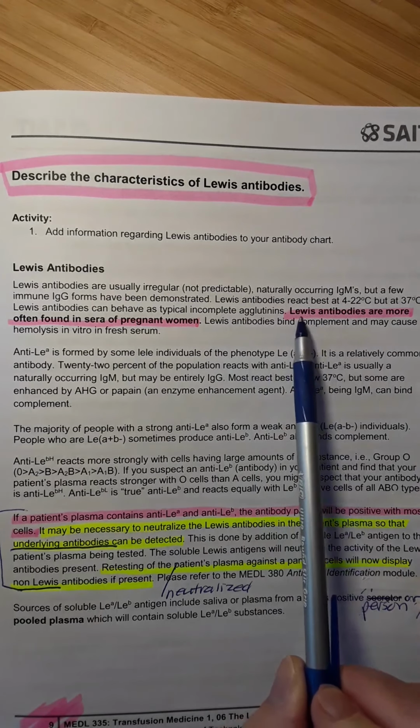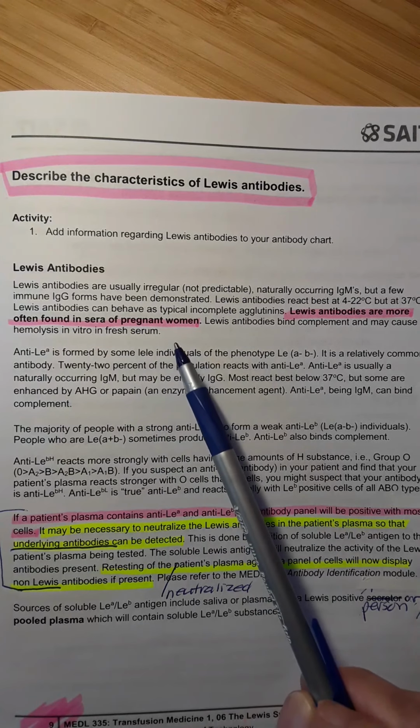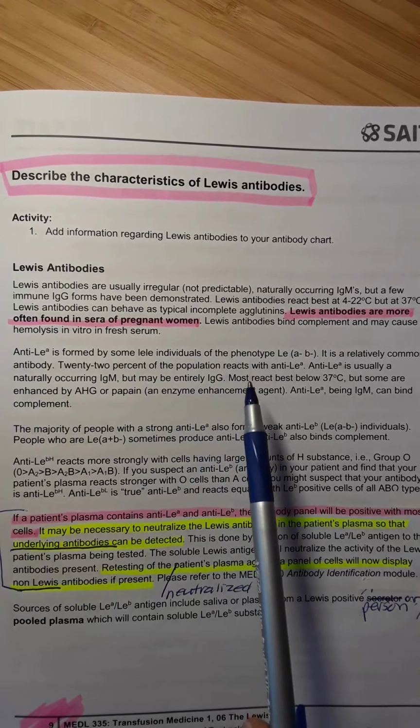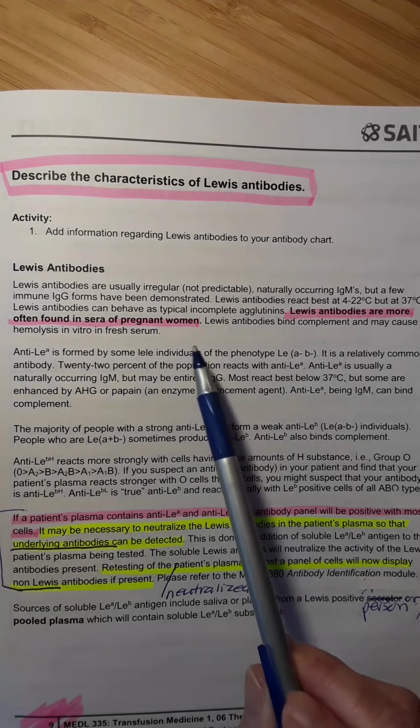One mentions that Lewis antibodies are more often found in the sera of pregnant women, which is really quite interesting. And people often will ask why.